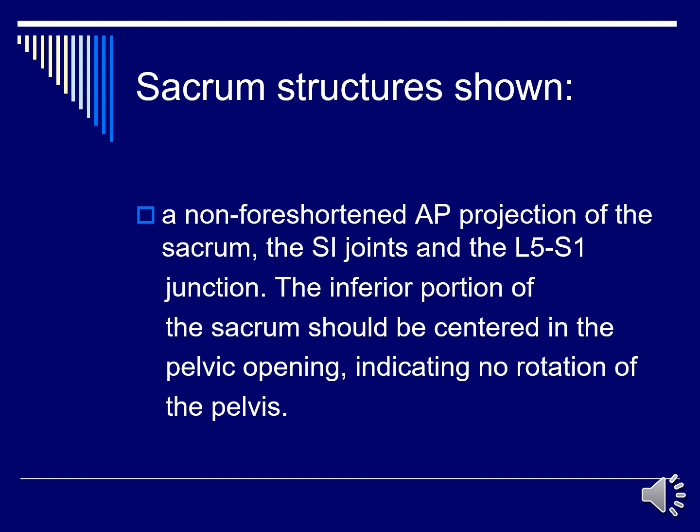Now the entire sacrum should clear the symphysis pubis with that angle on it. However, the coccyx may still be superimposed. You should be able to see the sacral foramen a little bit more open because that angle is going to help remove the convexity or the kyphotic curve on the sacrum.